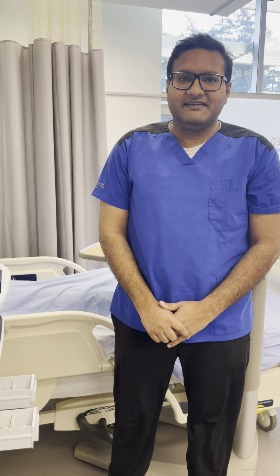Hello, my name is Mantasha. I'm a second-year nursing student at Camosun College. Today I'll be demonstrating intramuscular injection for my patient Pat Rees.